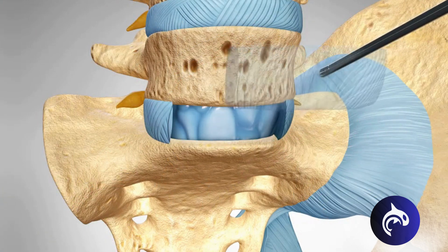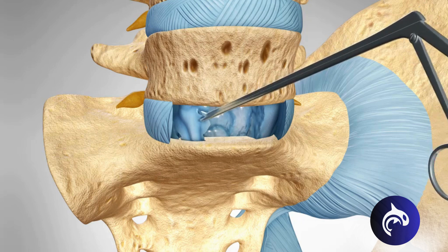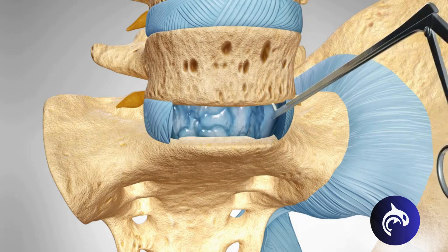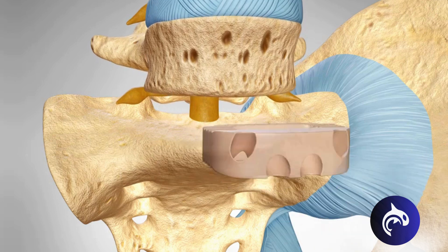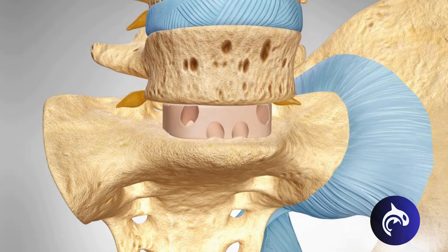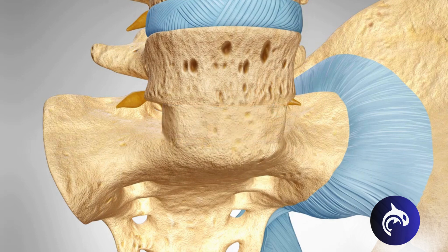The surgeon will then remove the intervertebral disc. When the disc space has been cleared, the surgeon will implant a metal, plastic, or bone spacer containing graft material between the two adjoining vertebrae. Screws may be placed through the spacer to add stability to the spine. As the spine heals, the vertebrae will fuse into a single solid bone.